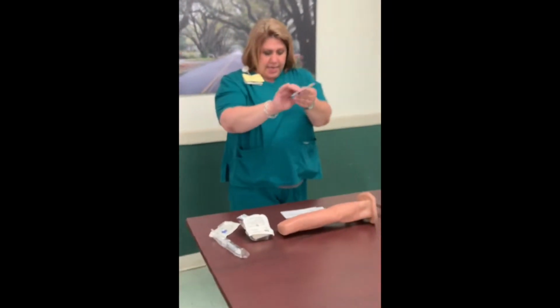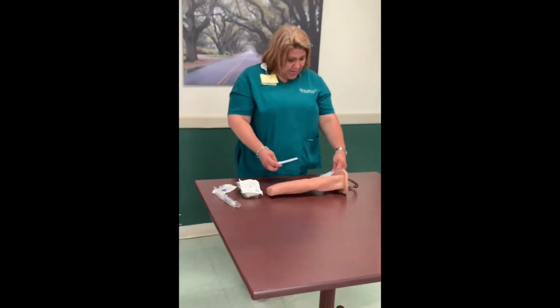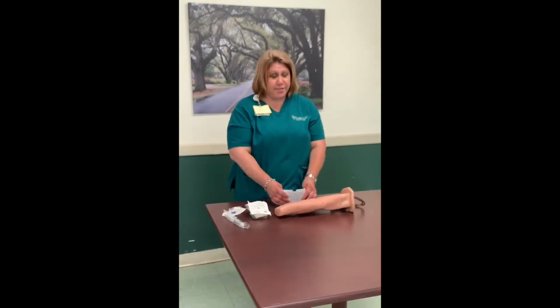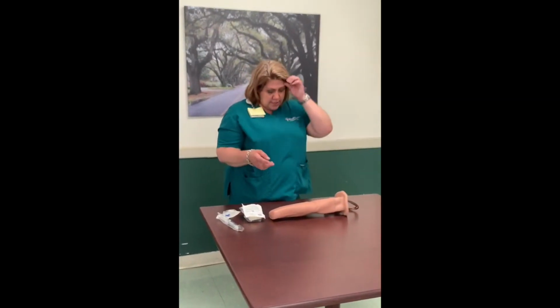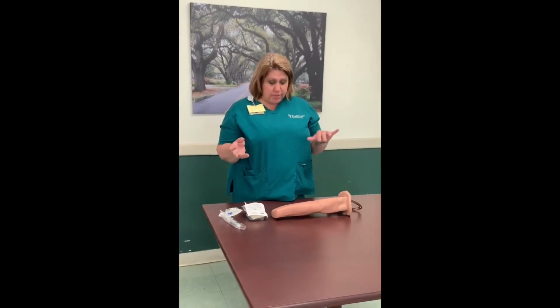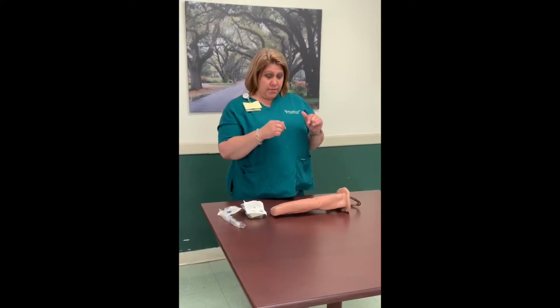Okay. And some of the things that can happen with an IV are extravasation, which is infiltration of a drug or fluid into the surrounding tissue. Infiltration, which is the drug or fluid infiltrating into the surrounding tissue at the insertion site when the catheter tip either goes through or doesn't go all the way through into the vein once you put the needle in.